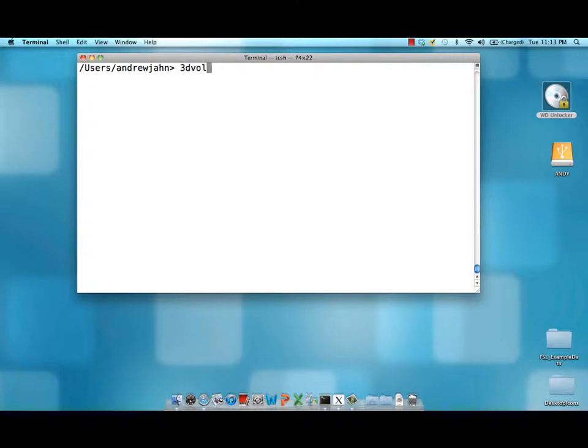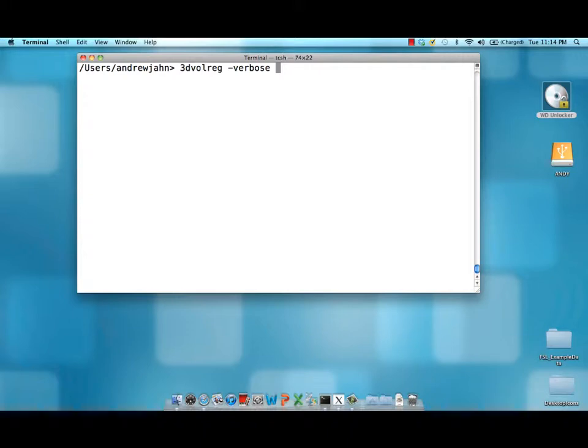To do that we use AFNI's 3D Volreg command. This is short for volume registration. I'm going to give it some options here. Verbose means print out everything that is calculated and computed and printed to the terminal.